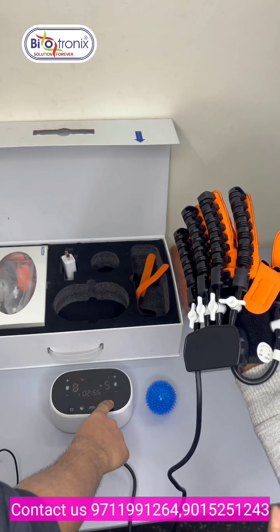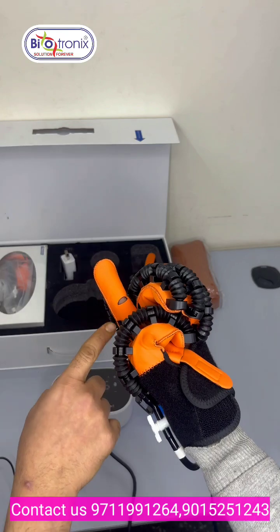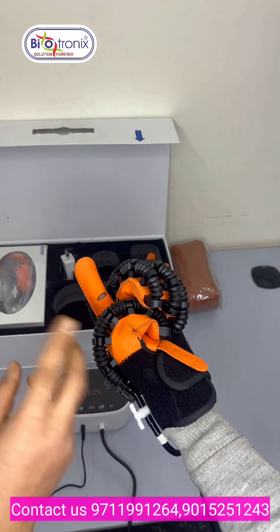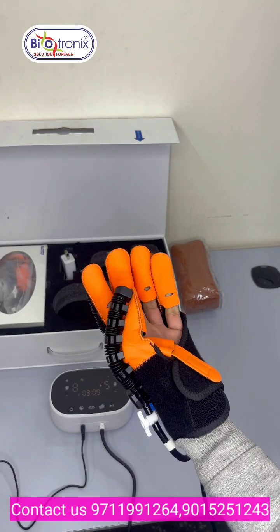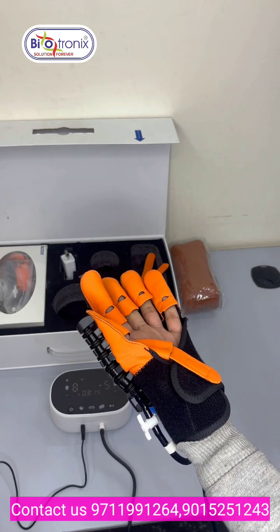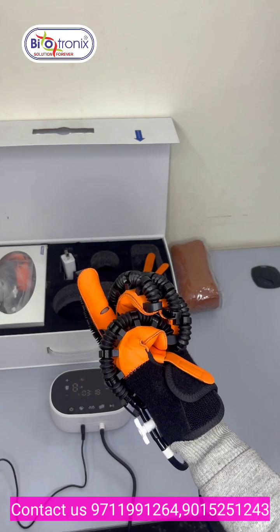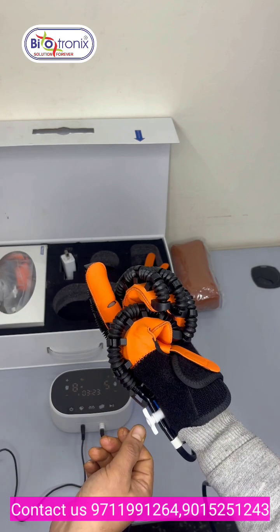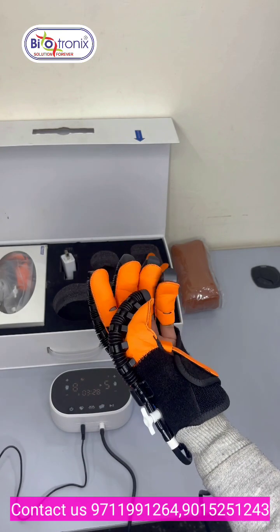Passive training. So you can see I have just opened the valve of that finger. By using that valve, I can close any finger I want, and the rest of the fingers will stay in the passive mode. So you can see this finger is now not in the working position. If the patient or doctor wants one or two fingers to close, he has to just open the valve, and then single finger control can be achieved.